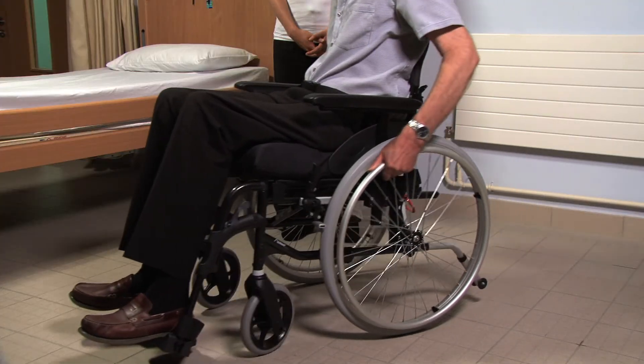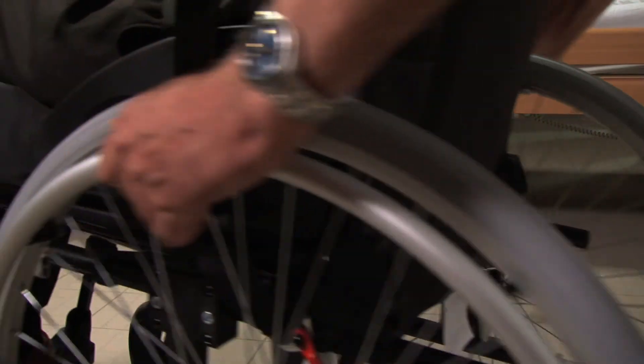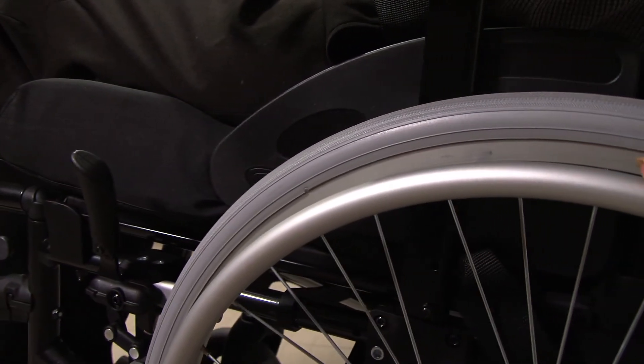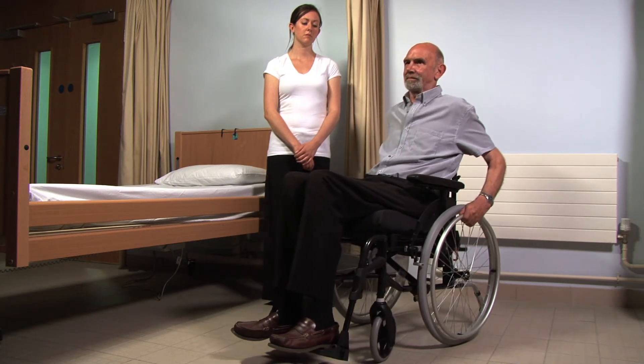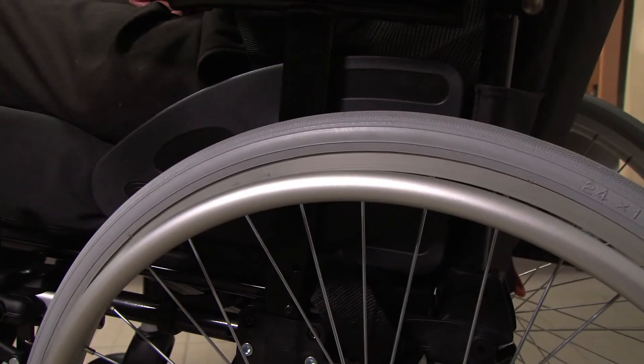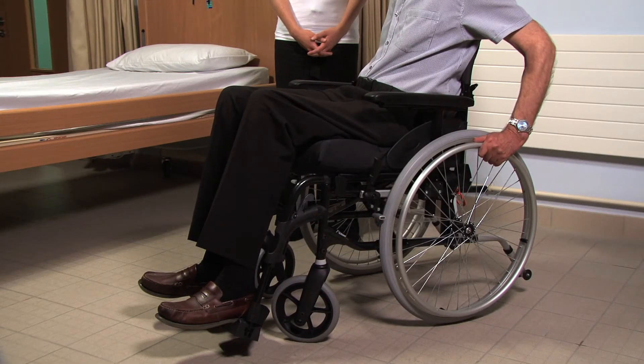The rims on the larger wheels at the back of the chair allow the user to propel themselves independently. The wheelchair user can stop the chair by giving a short push forward followed immediately by a short push backwards. When the chair needs to be stationary, the brake at the larger wheels should be locked.